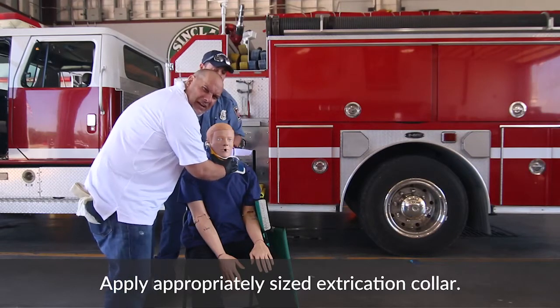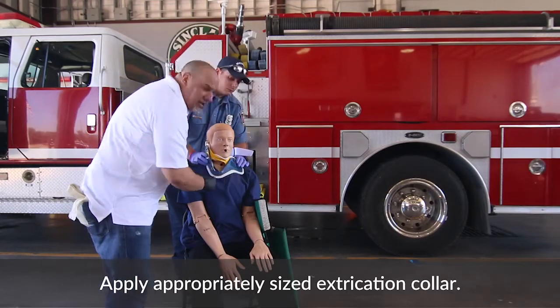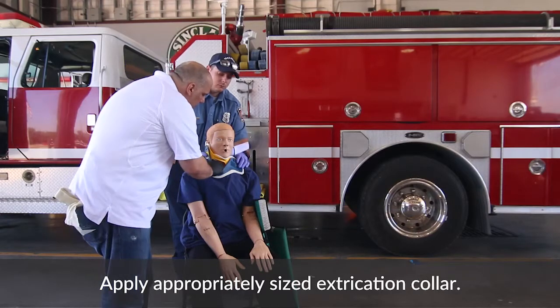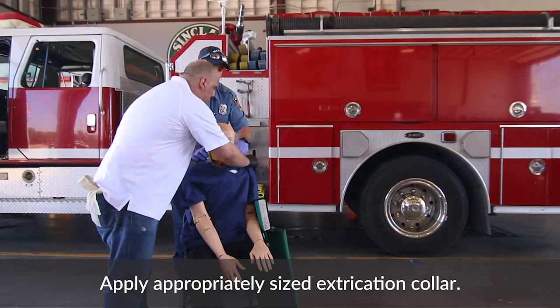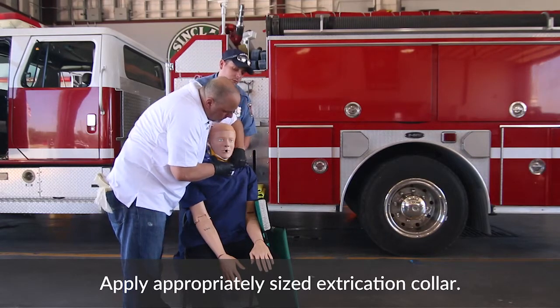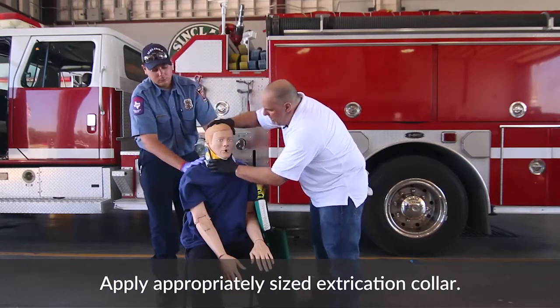I want to point something out before we secure the collar. This happens a lot when you see people putting on an extrication collar: their clothes are underneath the collar. What this could do is cut off circulation as the clothes bunch around. You really want to try to get the collar under the patient's clothes. Unfortunately, this may lead to having to cut the clothes, but you've got to do what's best for the patient. Then go ahead and secure the collar and make sure it's on right.